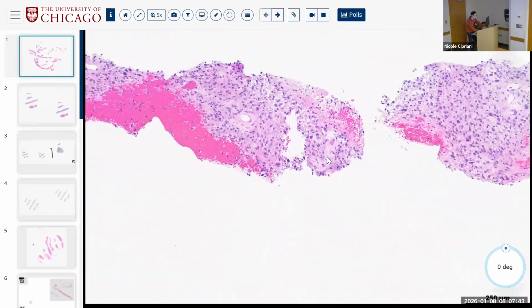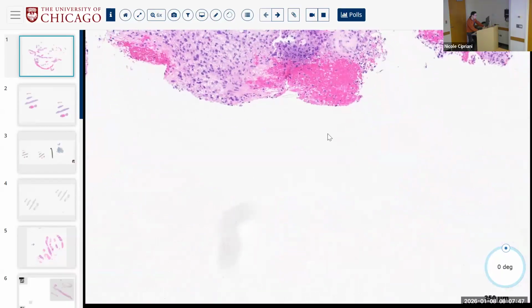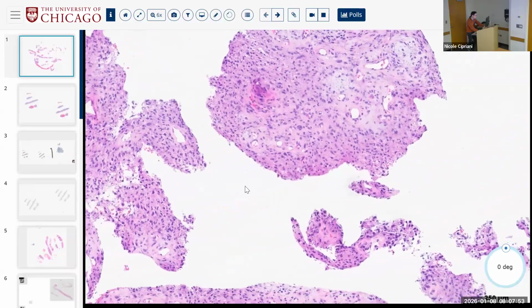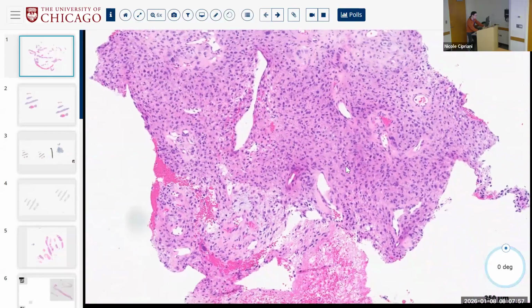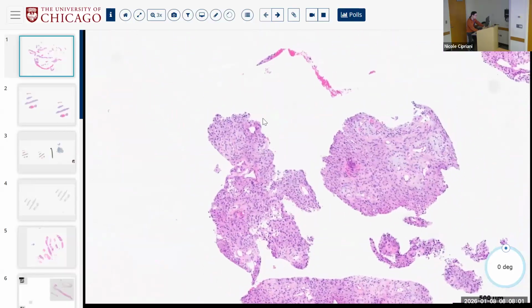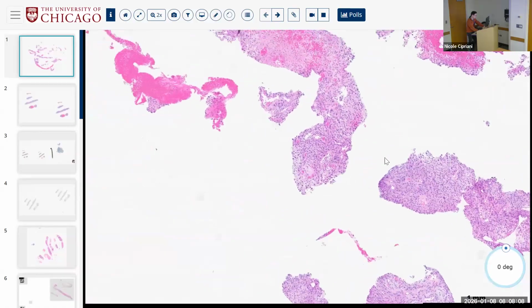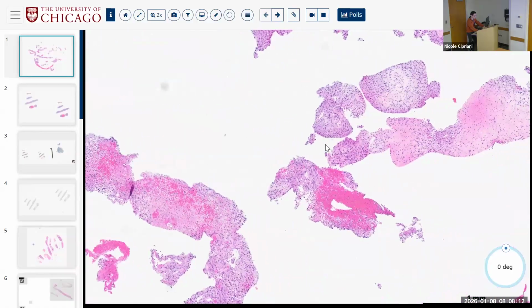I'm having a hard time going beyond the lipogenic tumor bucket. I know with a dedifferentiated liposarcoma, you would potentially see heterologous elements too. I'm not really seeing that here. I guess it's just dedifferentiated liposarcoma versus pleomorphic liposarcoma. That's as far as I can go for the differential.